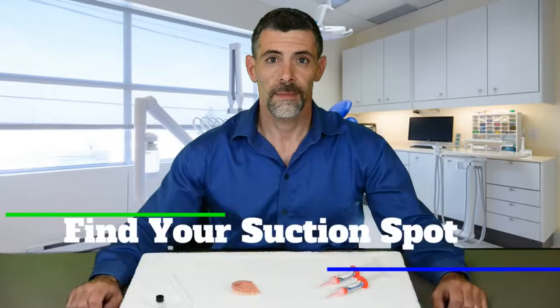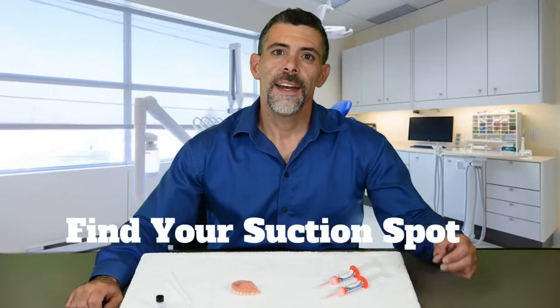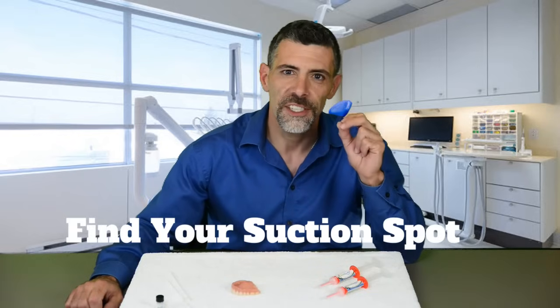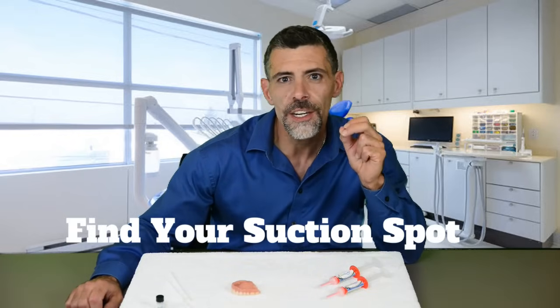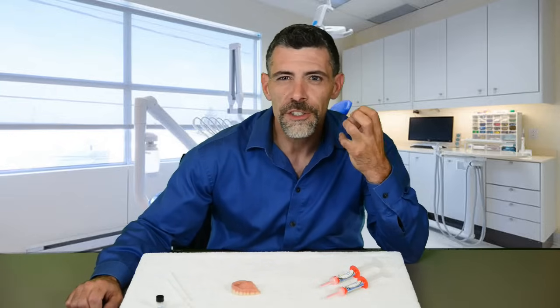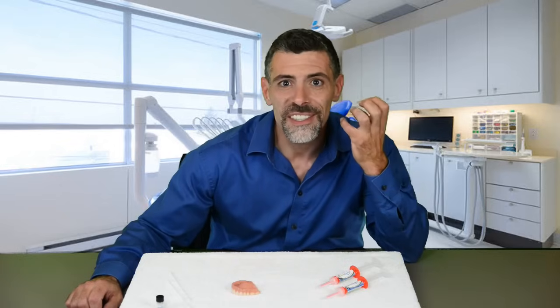The key to getting your best fit on your upper denture is to accurately seat that denture into your suction spot when you reline it. This is critical because your gums are always changing, but your palate never changes — your palate will always be your starting reference point during your reline. When your voids are filled while your denture is supported in your suction spot, it stays in your suction spot.